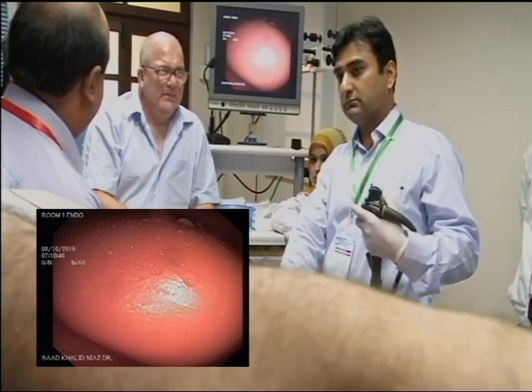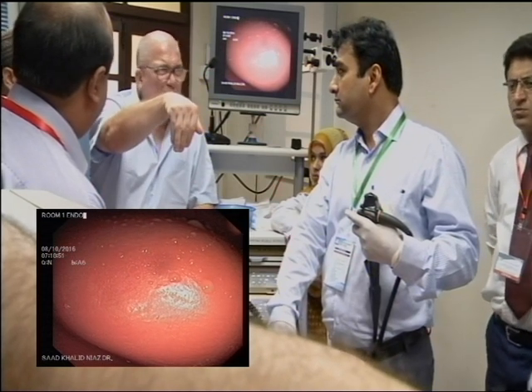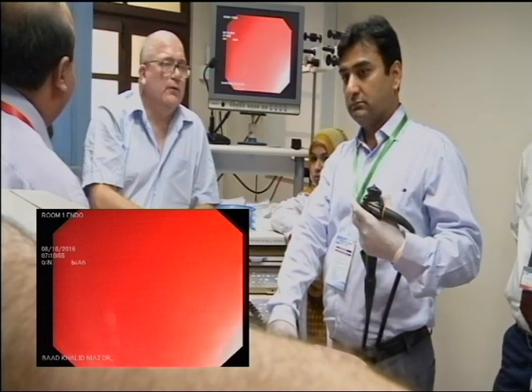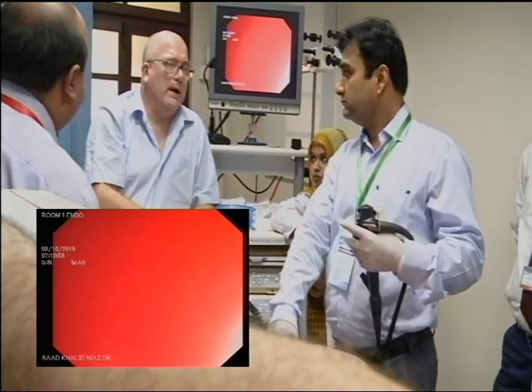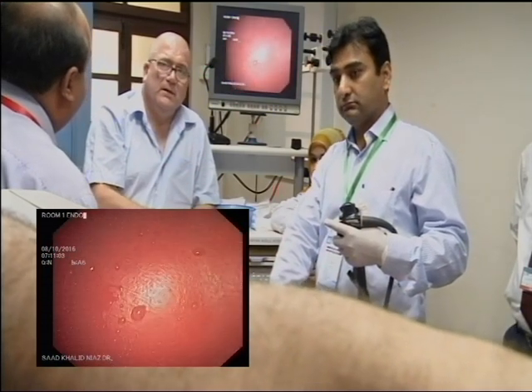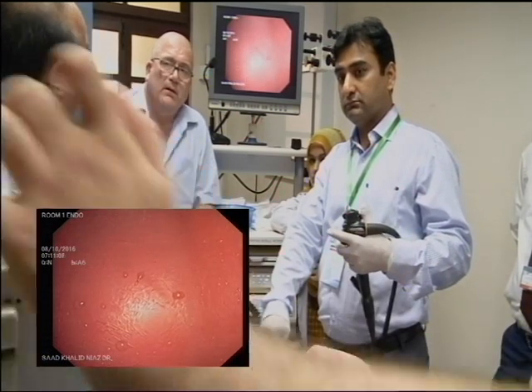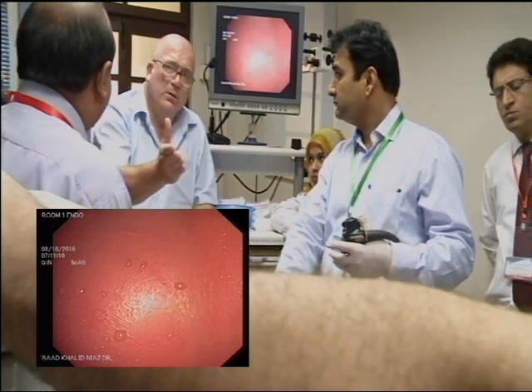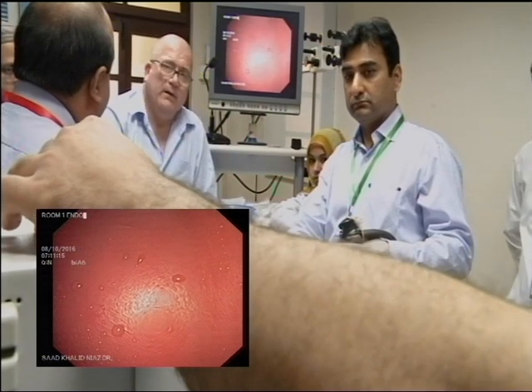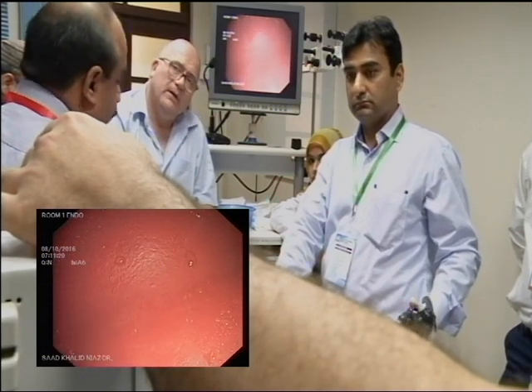Anti-clockwise is making the scope look left, and that's because he's got the big wheel tipped forward. Neutralise your big wheel. Draw the scope back. Draw it back another centimetre. Now, where's the lumen? Remember what happened when she was in the fold? Where did it end up being? You wanted to go blind, and where did it end up being? So, excellent. Anti-clockwise. Good.